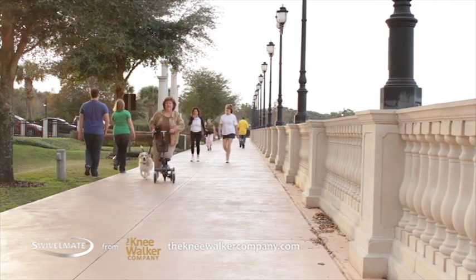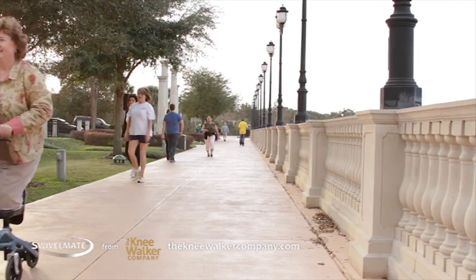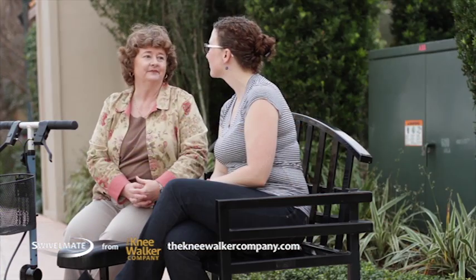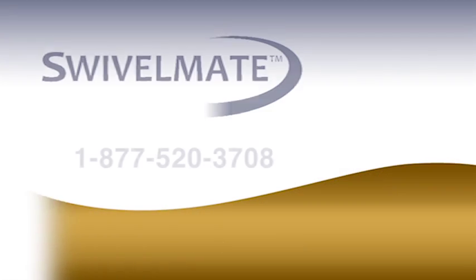With the help of your Swivelmate, getting out for some exercise is a walk in the park, making your recovery easier and more enjoyable. Order Swivelmate today and find out how easy your recovery can be.